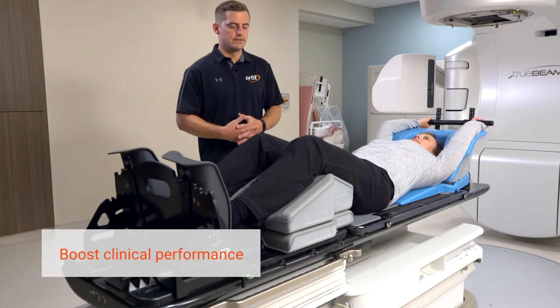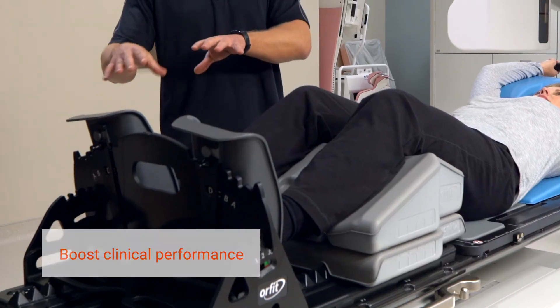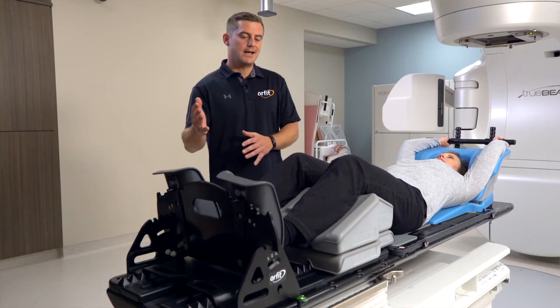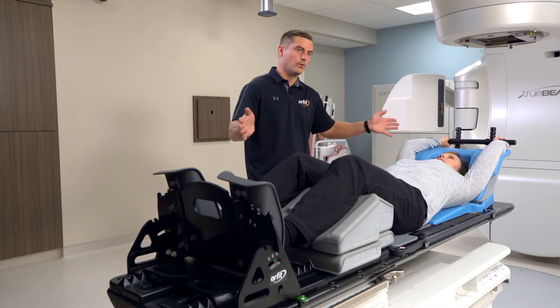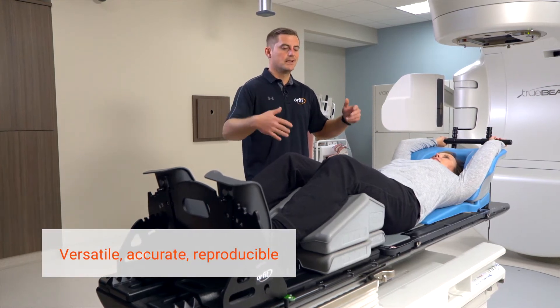Moving on to reproducibility — that's another key feature of the AIO Gen 3.0. We have these foot positioners here, so the foot positioners mixed with the head holder can sandwich the patient in so the longitudinal position is never in question.